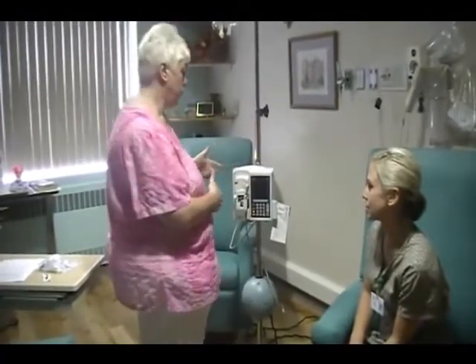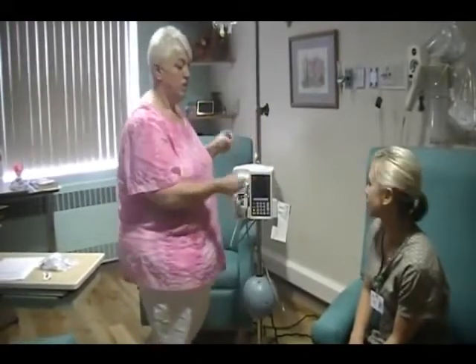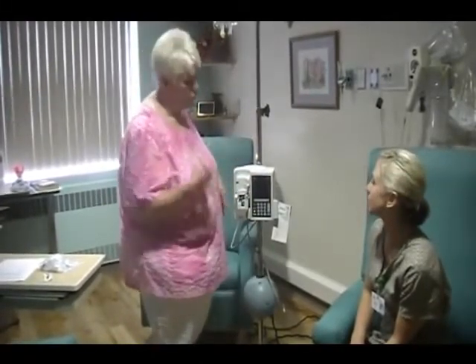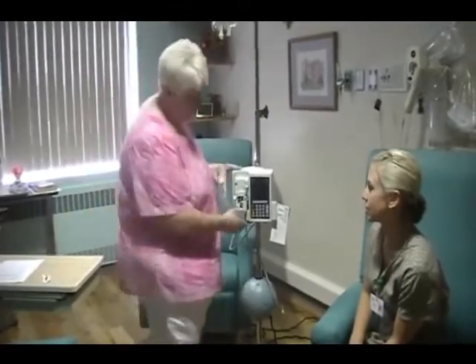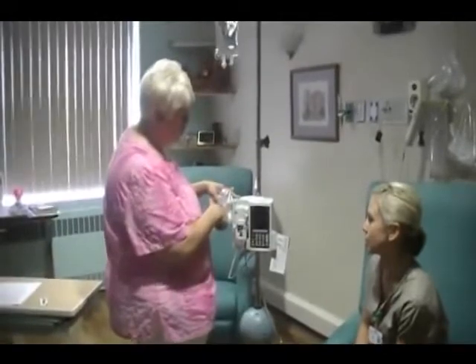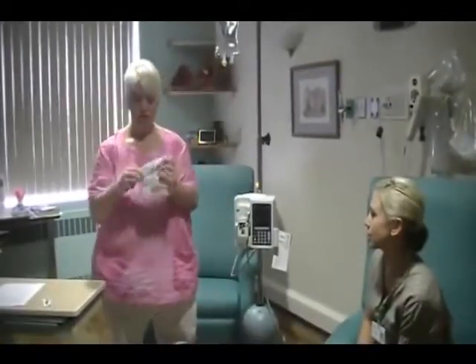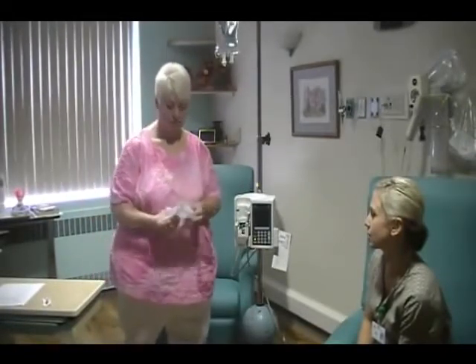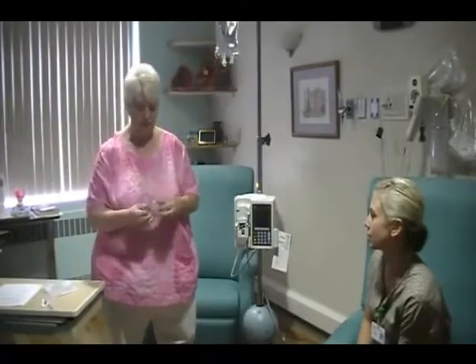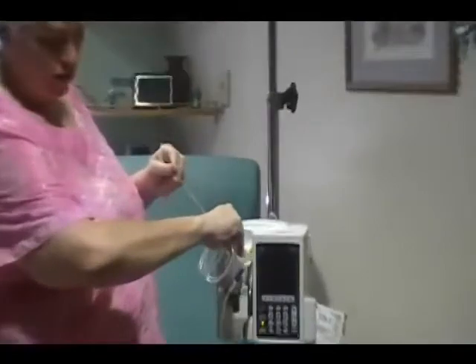You always want to make sure it's a clean pump when you're taking it into a patient's room. I already moved the sanitizer strip off of it, but I know this was a clean pump when I started. So first of all, prime your pump. You're going to set up Line A by using a Primary IV Plum Set, and that has a cartridge that fits right into here.